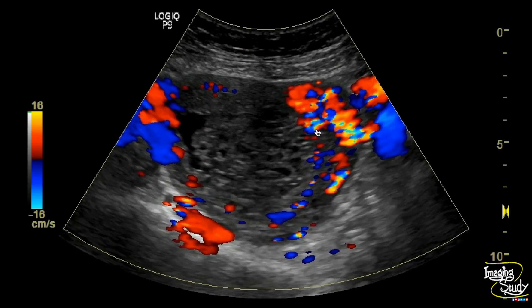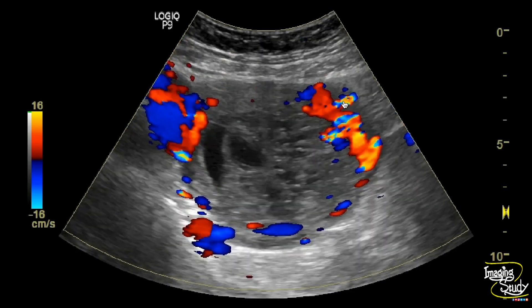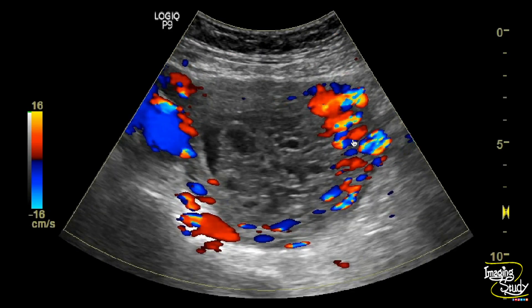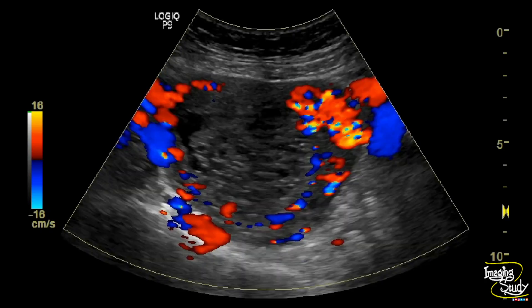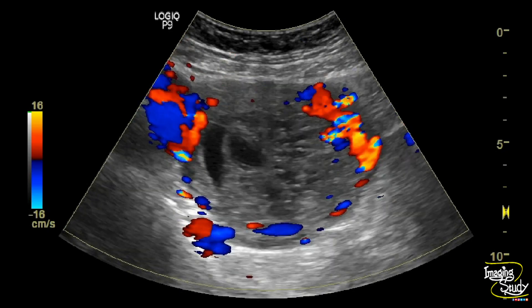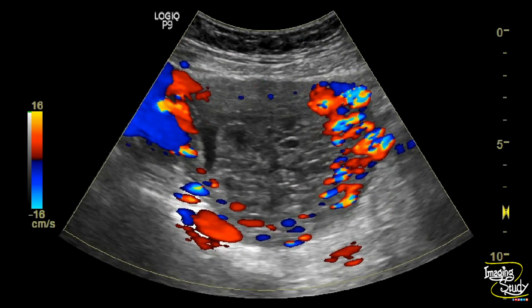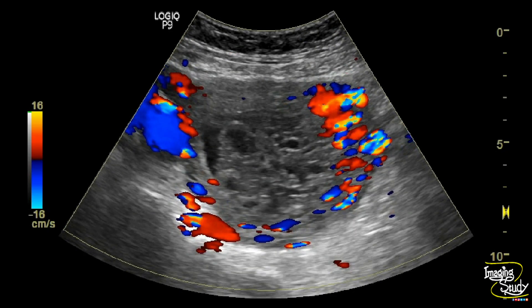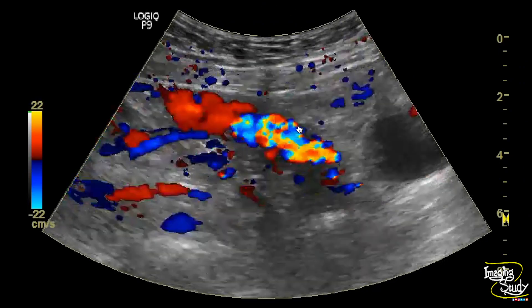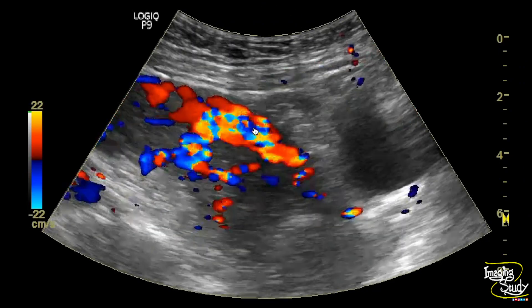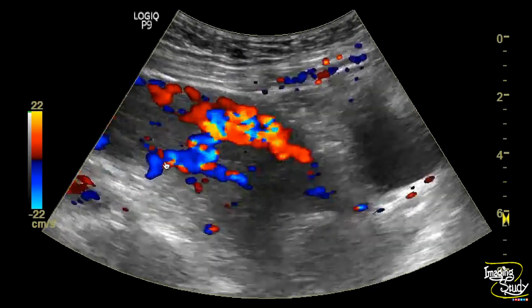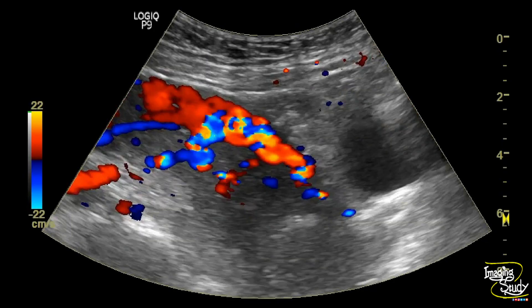On this transverse section you can see these tortuous vessels — or lacunar vessels — at the left anterolateral part, bridging the molar tissue to the myometrium, indicating invasion. Here is the longitudinal view at the left lateral aspect where you can see these tortuous vessels, and this is the uterine artery supplying these tortuous vessels.